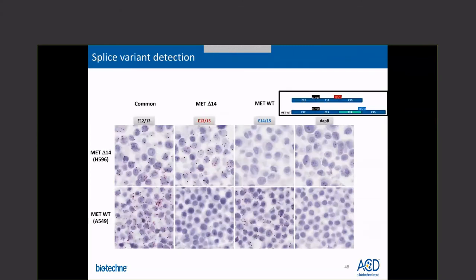Another study was done on H596 cell lines that have the MET variant, whereas the A549 cells have the wild type MET transcript. The variant-specific probe shows positive signal only in the H596 cells and not in the A549 cells. Similarly, the wild-type specific probe only detects signal in the A549 cells. While the probe designed against the common region of both the wild-type and variant transcript shows positive signal in both cell lines, the probe for dapB shows no signal, indicating no background. This demonstrates the specificity of the BaseScope probe in detecting specific splice variants.